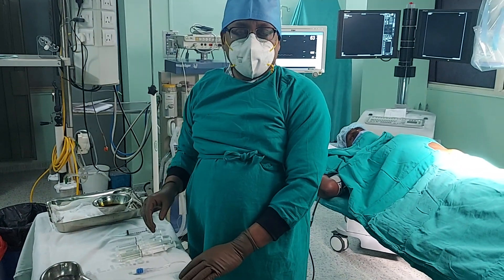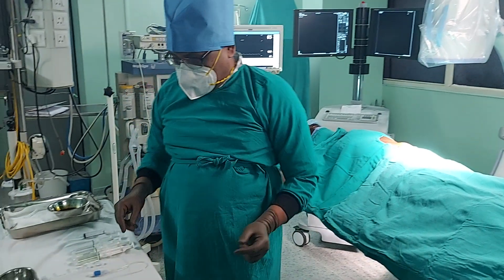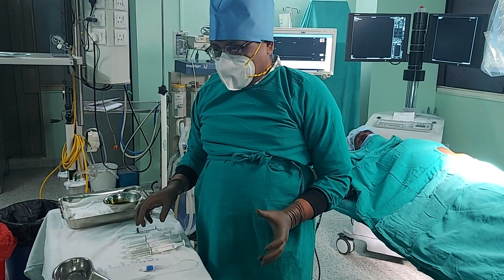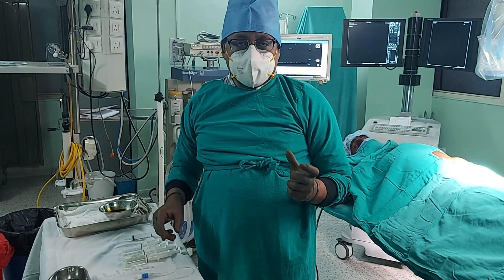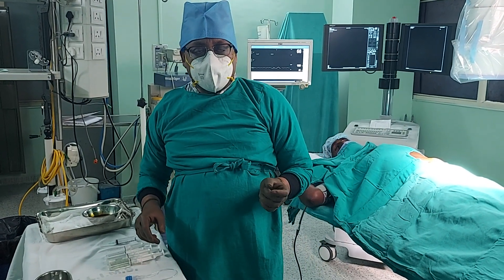Today we are going to do the refilling process of intrathecal morphine pump in our patient of multiple myeloma. This is the pump of Tichomate company with a 60 ml volume and with a delivery rate of 0.5 ml per 24 hours.